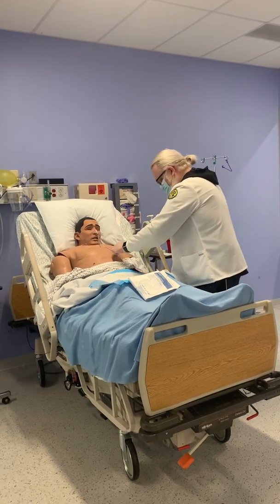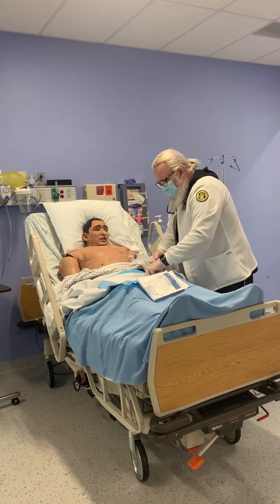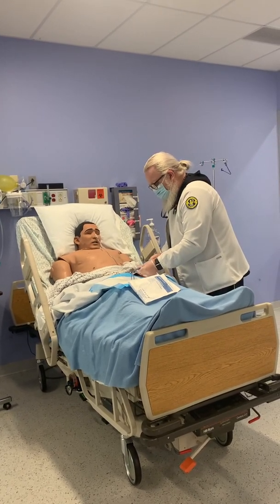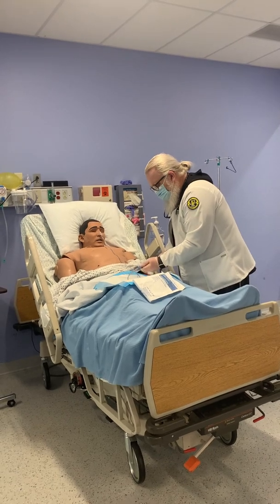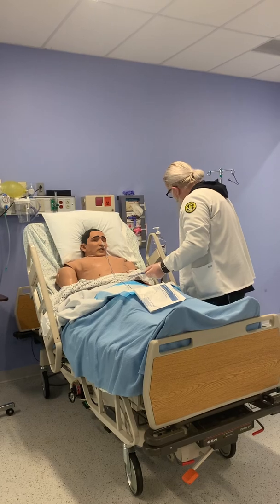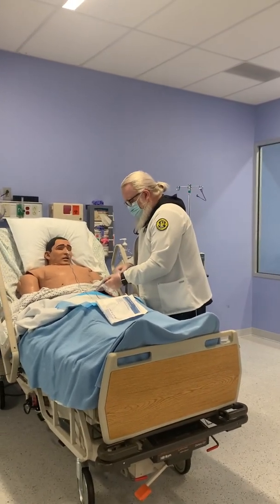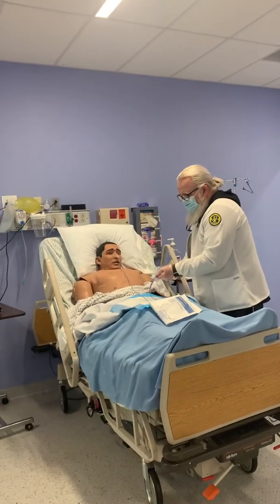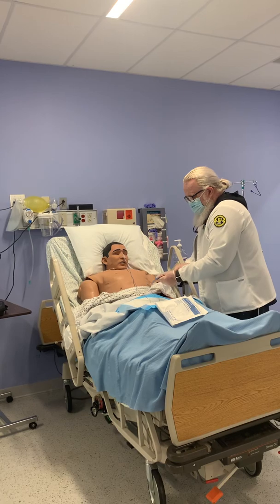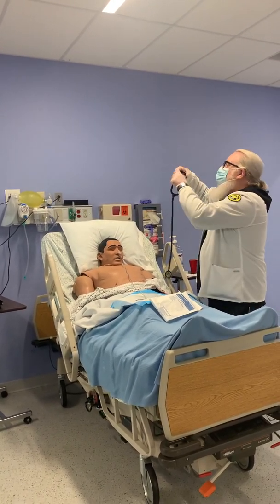Now what I'm going to do, I'm going to drop some of the contents here. Drop just a little bit. Just squirt it out. Put it under 4. Next thing I'm going to do is insert about 10 to 20 mLs. And first I'm gonna just listen to see if we're in place.